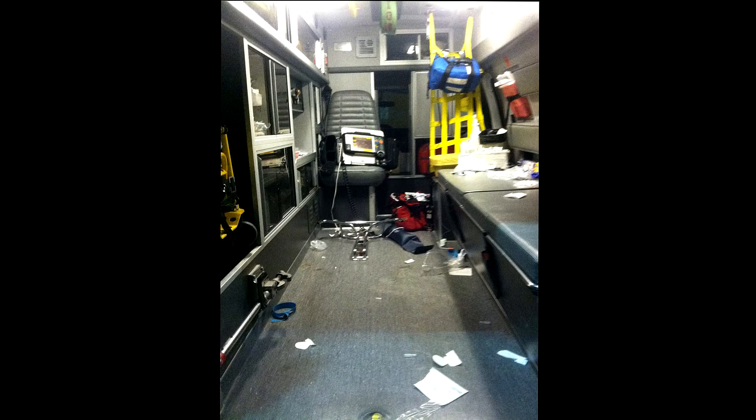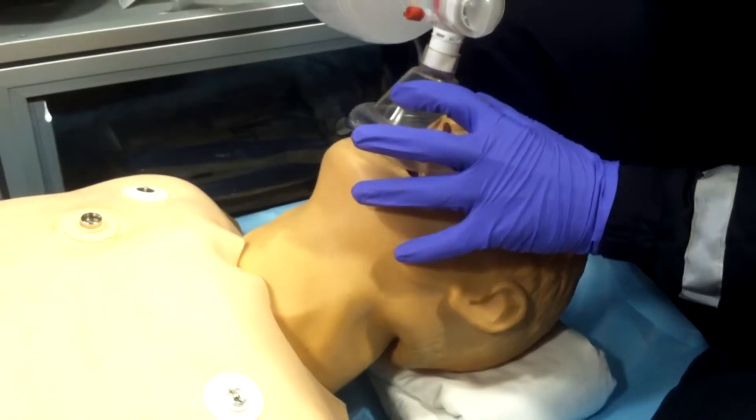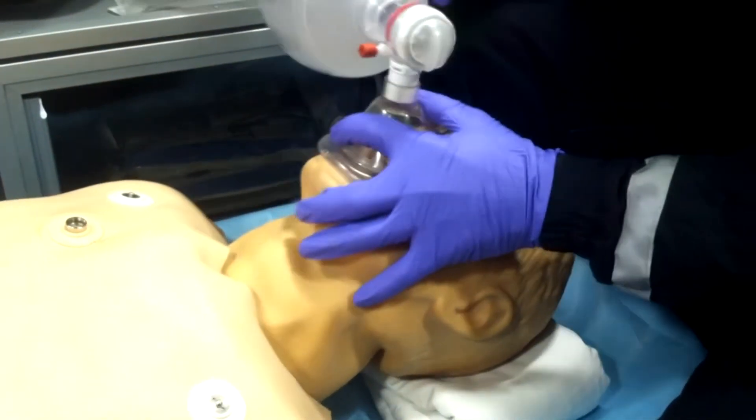Hey everybody, how you doing? My name is Charlie and today we are going over airway maintenance — more specifically, we're going to go over proper BVM technique and LMA Supreme placement.